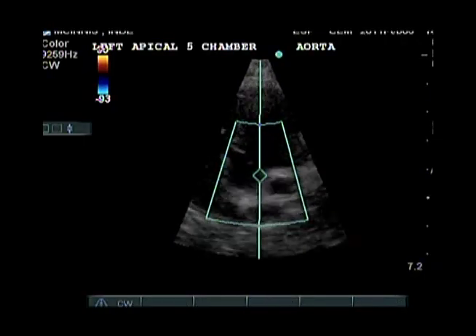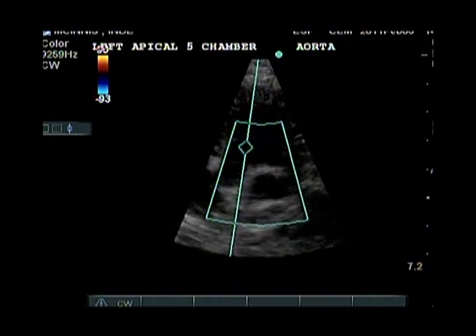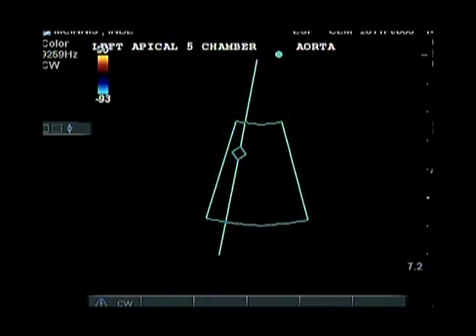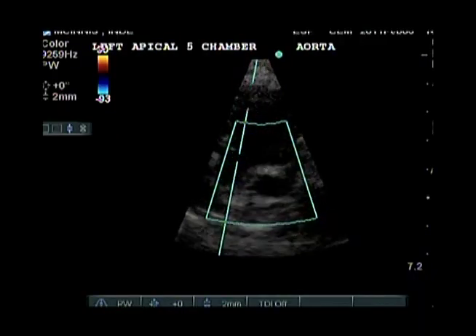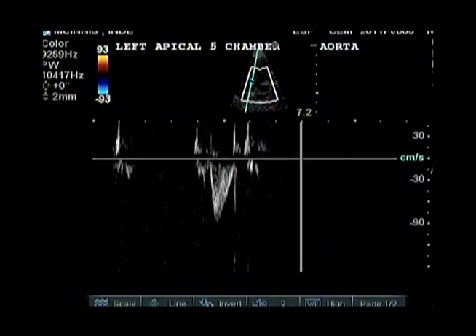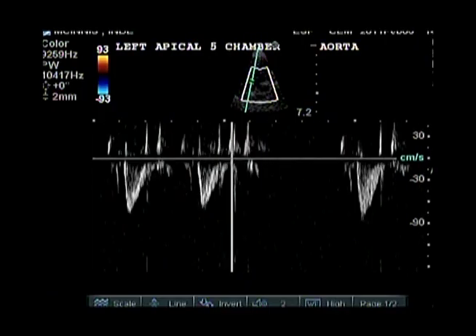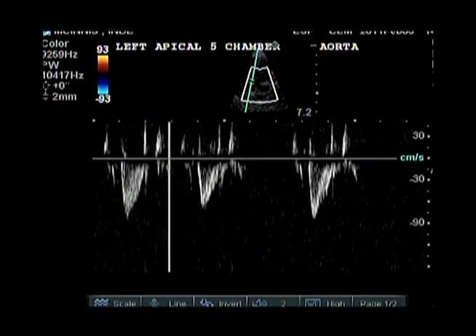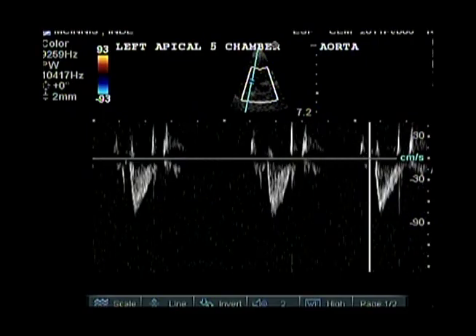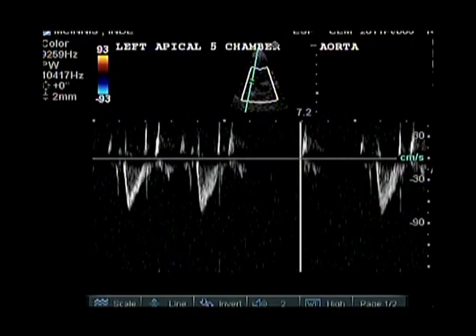Activate Spectral Doppler. You may also need to raise the baseline and increase the pulse repetition frequency to get the most accurate measurement. Observe a number of waveforms and freeze the image. Use Cine Loop to scroll backwards and choose the largest waveform.